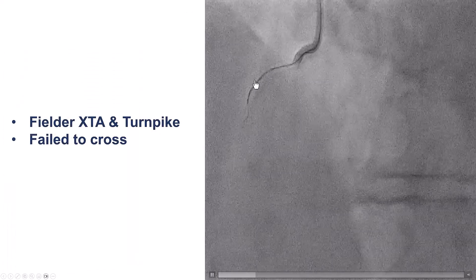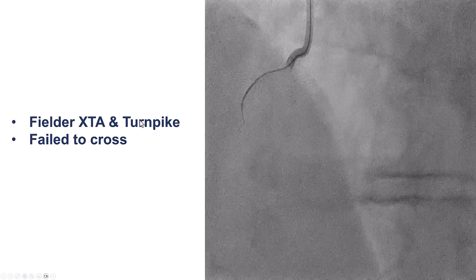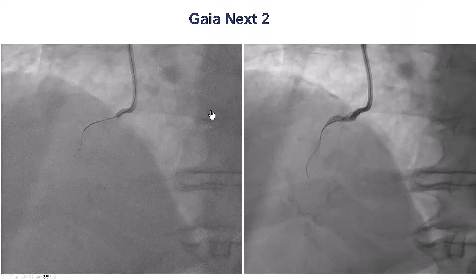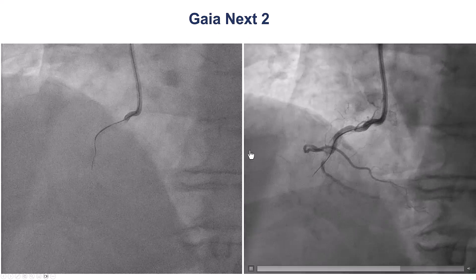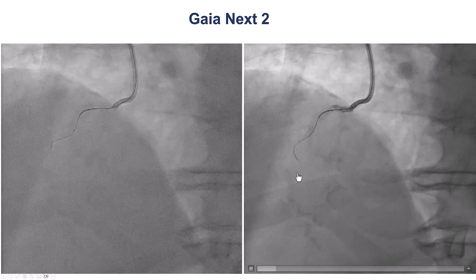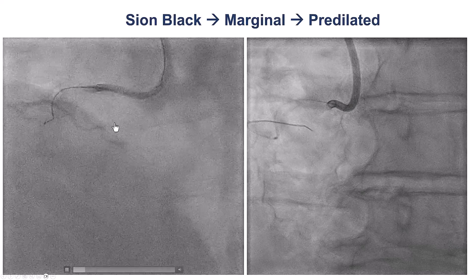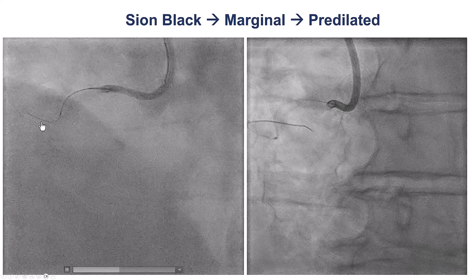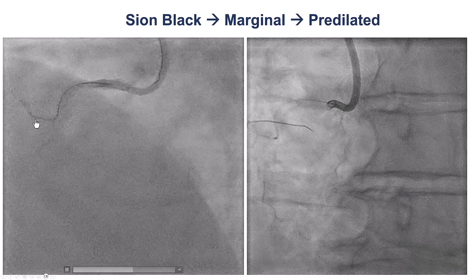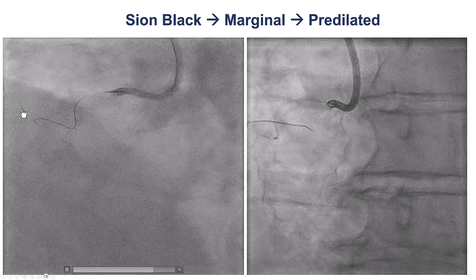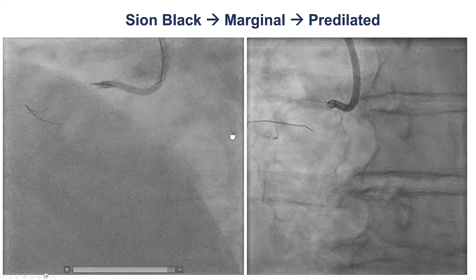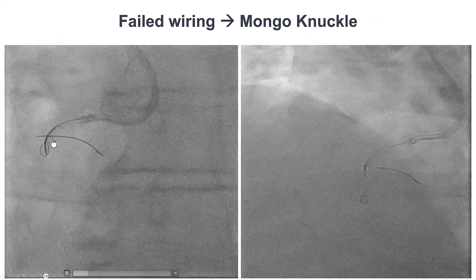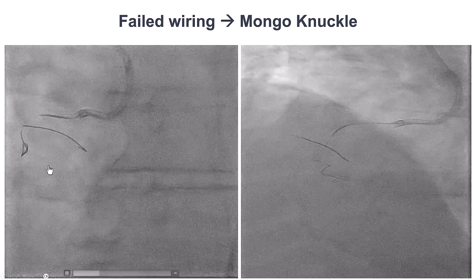We first tried using a microcatheter and a polymer-jacketed guide wire, but we were unable to cross. We used a Gaia-Next-2 that appeared to be going outside the vessel architecture. We then used a Confianza Pro Black that went into an acute marginal branch located next to the proximal cap of the lesion. We pre-dilated into the branch in an open-sesame fashion, but we were still unable to advance a wire through the mid-right coronary artery.